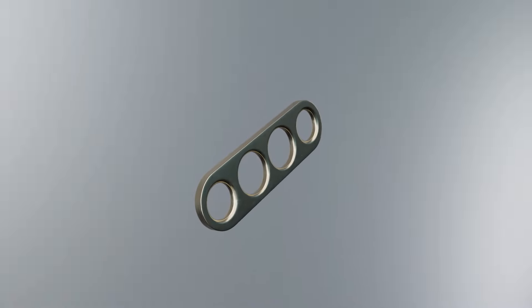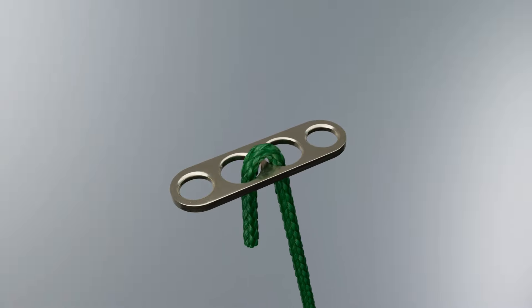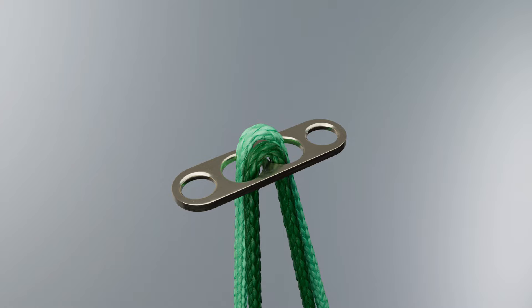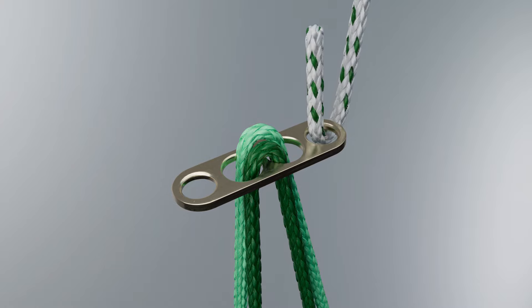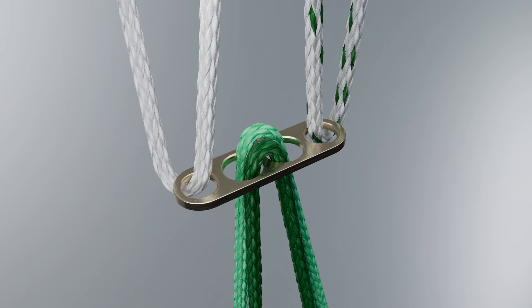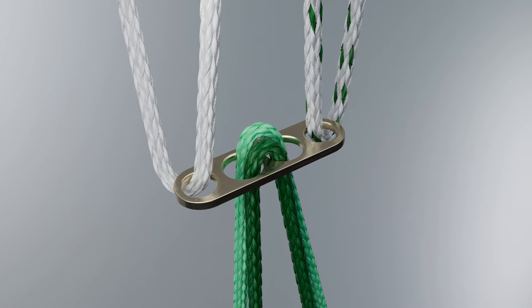The cinch sutures consist of one No. 2 dark green and one No. 2 light green non-absorbable braided suture placed through the center holes of the button. The toggle sutures consist of one No. 2 light green and one No. 2 white non-absorbable braided suture placed through each end hole of the button. These sutures will hold the implant and provide additional stability to the knee.